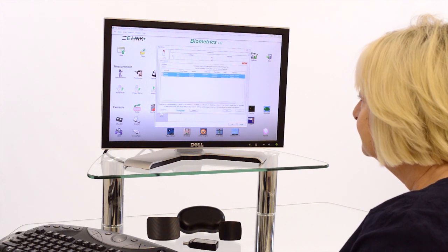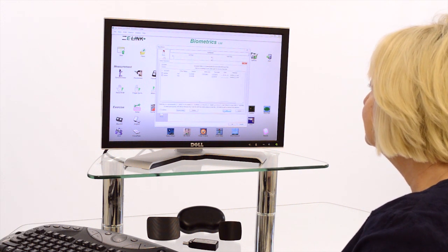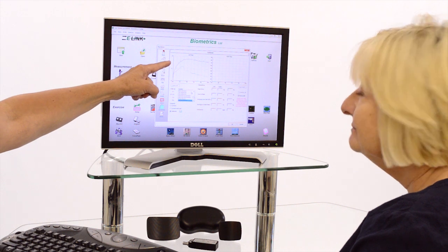All tests are available for immediate viewing, helping both the patient and clinician objectively discuss results.